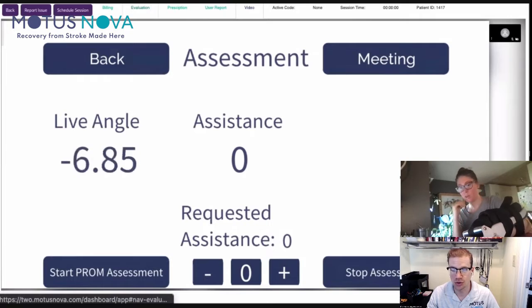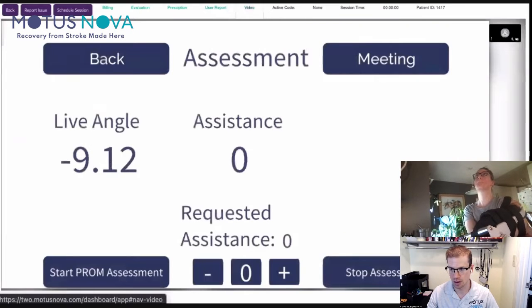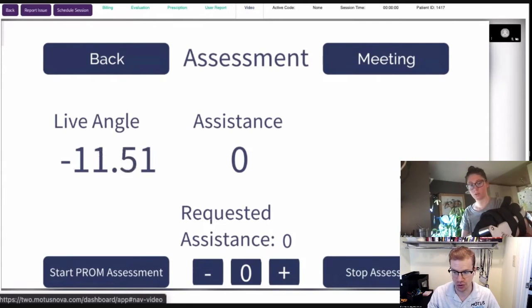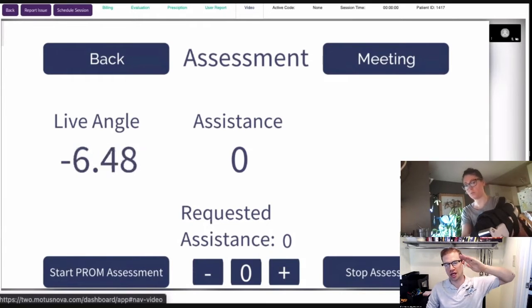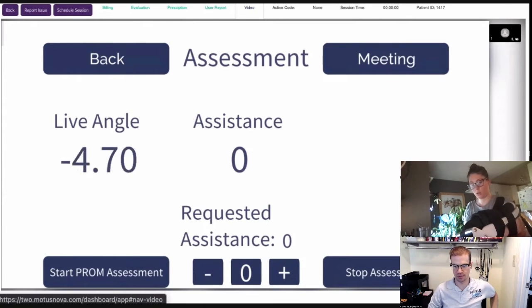Well, Catherine, let's go ahead and do the range of motion then. Let's have you try to move up as far as you can for me. Okay. So this is interesting. You're getting that reciprocal movement, right? We'll talk through it in a second, but go ahead and relax for me. I'm going to have you try to move down as far as you can into flexion. Interesting. Very good. Okay. Let's have you relax. Let's have you try to move down again as far as you can for me.